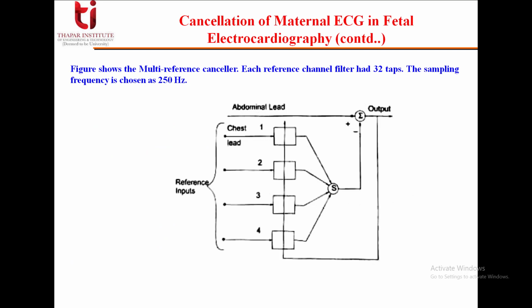Now this figure shows the multi-reference canceller. Each reference channel filter had 32 taps and the sampling frequency is chosen as 250 Hz. So you can see these are the multiple reference inputs.